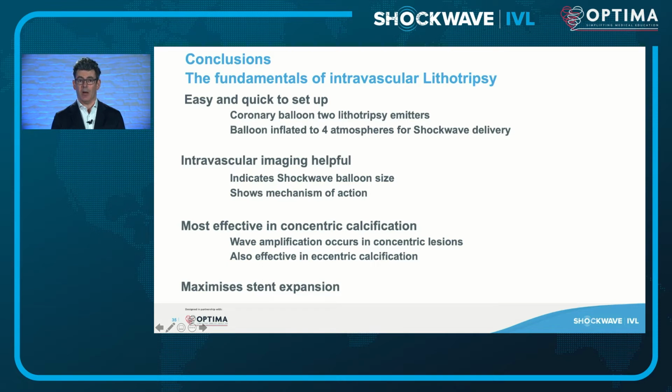Intravascular imaging is helpful. Firstly, it indicates the balloon size that you need to use, and it shows the mechanism of action. IVL is most effective in concentric calcification. Wave amplification can occur in concentric lesions, but it's also effective in eccentric calcification. And the goal of delivering shockwave energy is to maximize stent expansion.